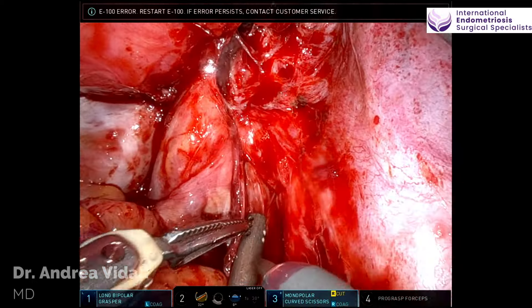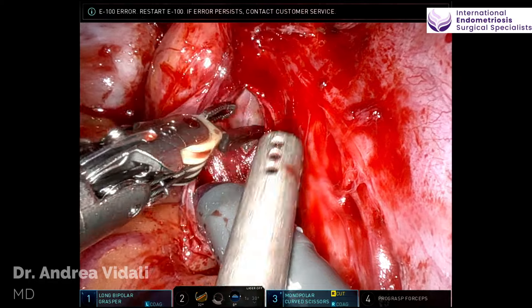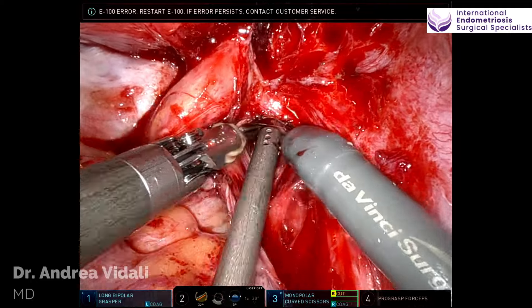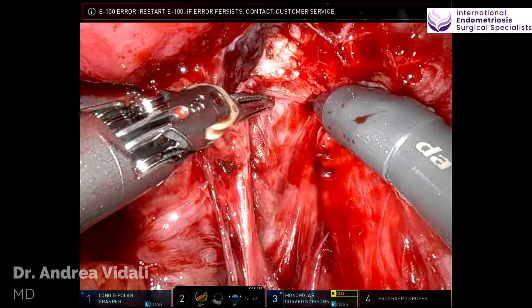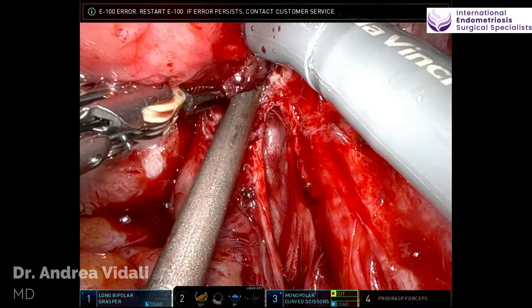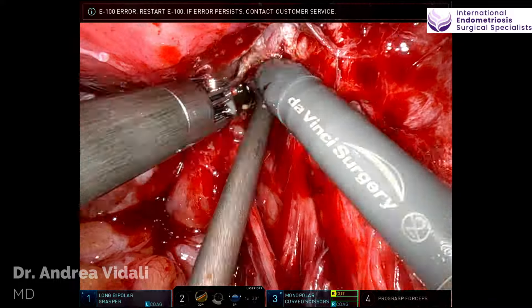Let's get on with the operation. I'm sorry I couldn't give you a full panoramic view, but we started recording just a tad bit late. Starting on the right side. The first thing I'd like to mention about my technique is that I use a technique that does not involve laterality.